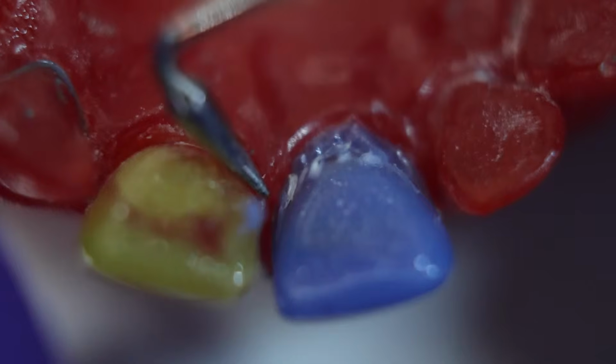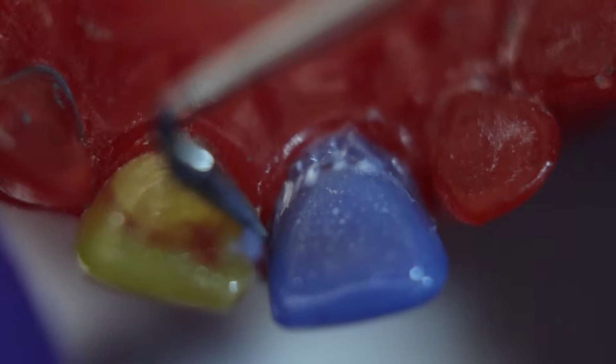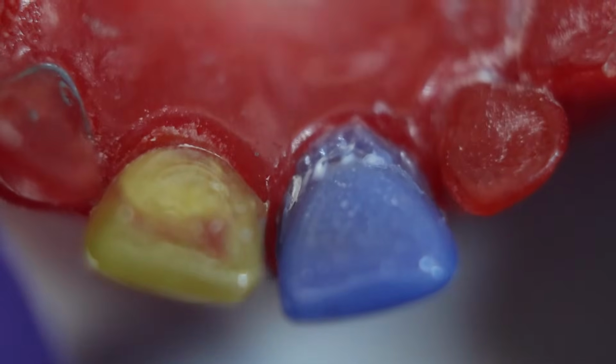If you don't remove this, it will get cured with the crown. So remove everything that is excess.